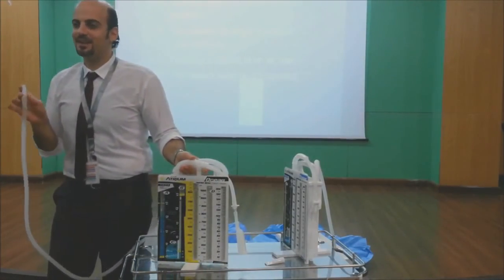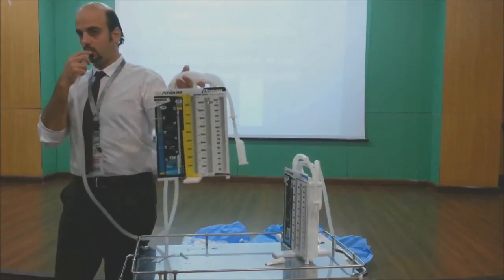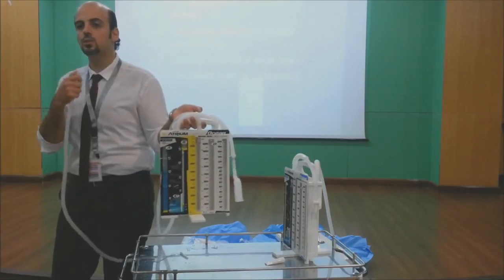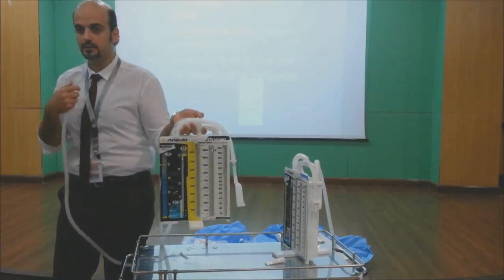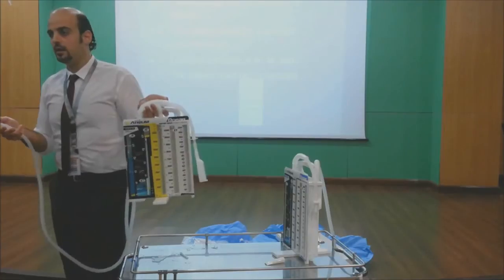This is a normal breathing, okay? Inspiration will create a more negative pressure. It's like the water, right? The water prevents me. I cannot suck air. I can't. But I can blow it easily. This is a one-way valve.